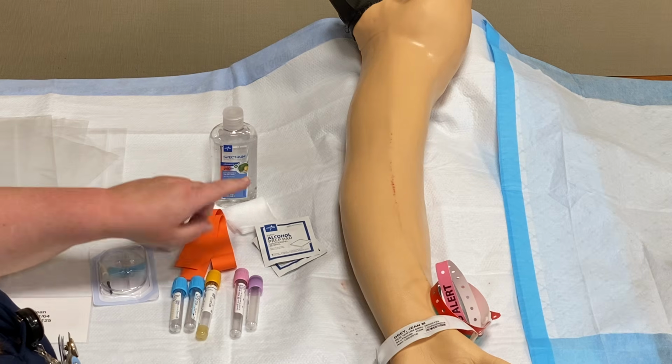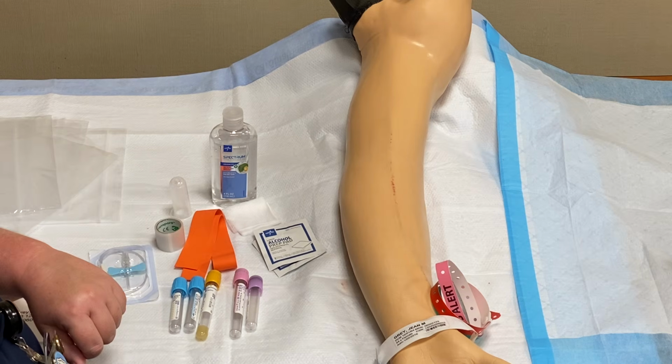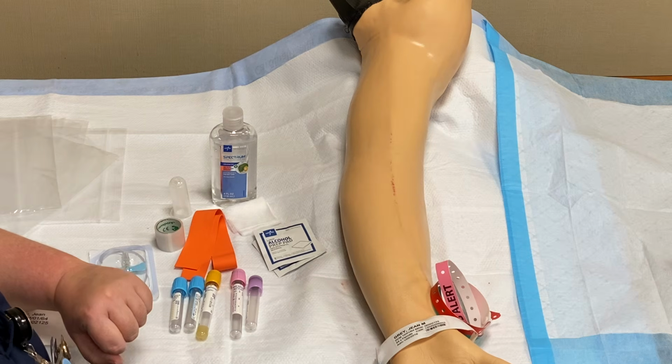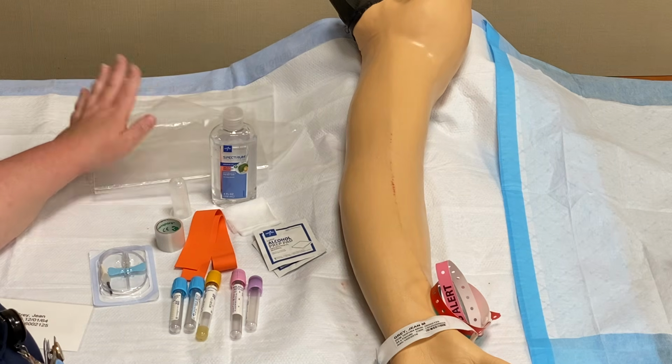I want to grab gauze, alcohol, tourniquet, and on all of these things, the expiration date will be on the box in the room. On all of the tubes, the expiration date is on the label. I also want to make sure that I bring in bags so that I can double bag my specimen to send it to the lab.